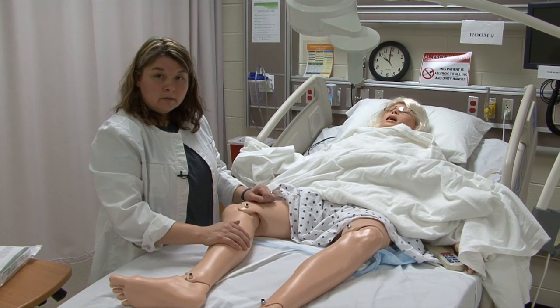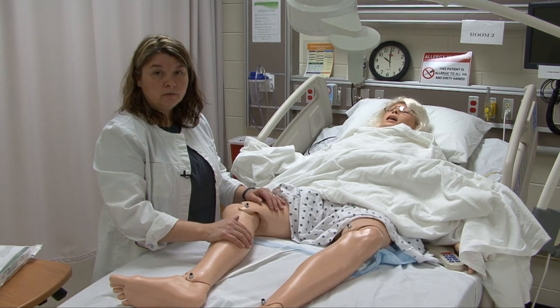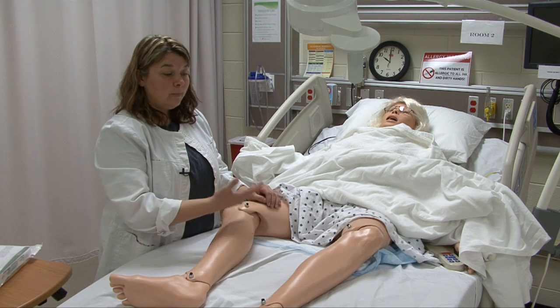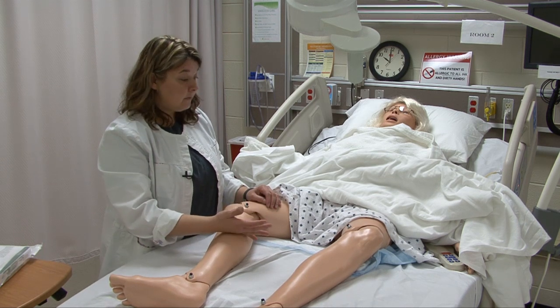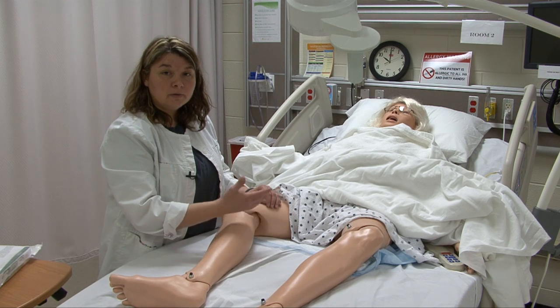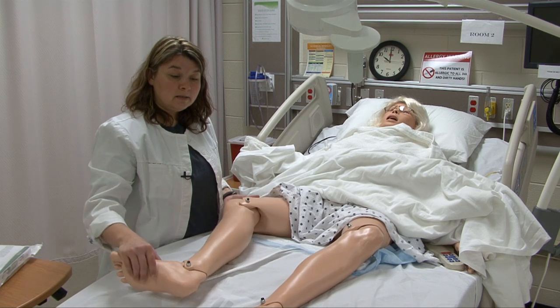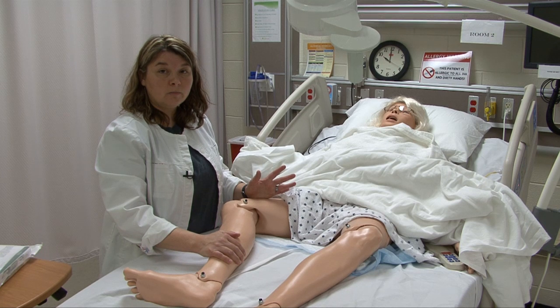The next thing we're going to do is perform perineal care on Mrs. Smith before we get started. You always want to do this with any patient you're going to catheterize to make sure the patient is clean — no stool or anything that would lead to a catheter-associated urinary tract infection. This also allows you to assess your patient's anatomy to see if you can find the urethra easily, and assess her movement and need for assistance.